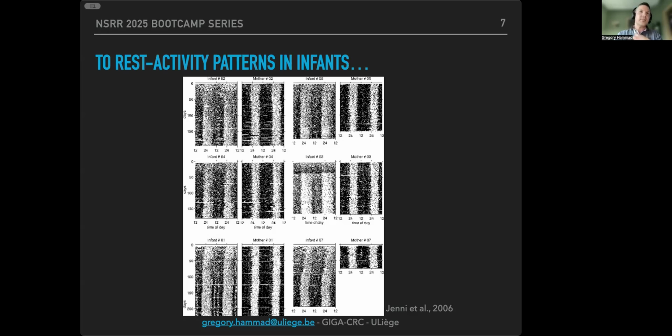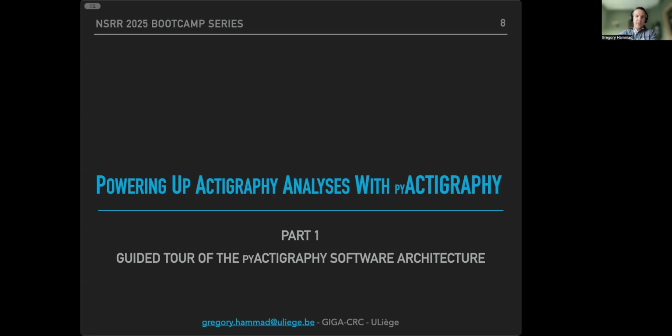Okay, so now it's done. That was my brief overview of a few of the things that I find interesting. Now maybe we should move to giving you a sense of how the pyActigraphy software is built.